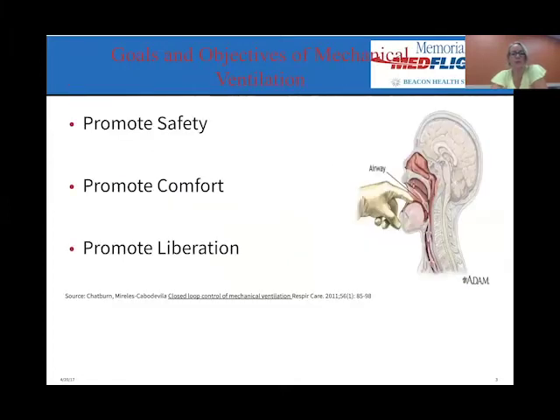The goals and objectives of mechanical ventilation are, one, to promote safety for your patient, comfort, and ideally, everything we do on the ventilator is to lead to liberation or weaning the patient off the vent. So those are the main objectives that you want to think about when you're ventilating a patient.